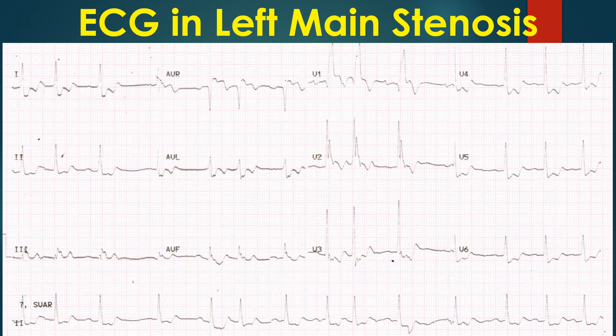In addition to ST elevation in AVR, this ECG also shows Q in V1 followed by a tall slurred R, called QRBBB, indicative of anterior wall infarction with right bundle branch block. The initial R of the RSR pattern expected in right bundle branch block is knocked off by the infarction. Multiple supraventricular ectopics are also seen in the ECG.